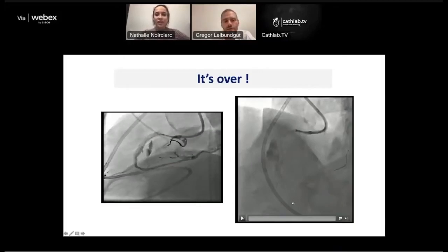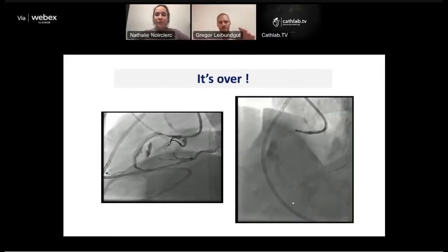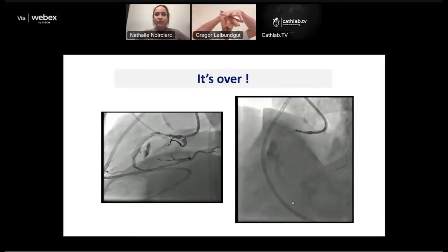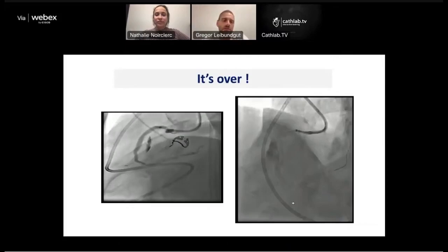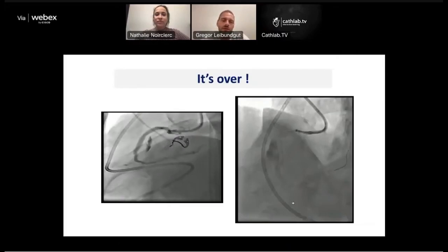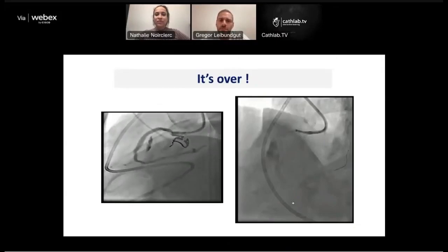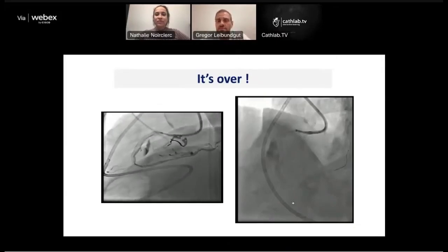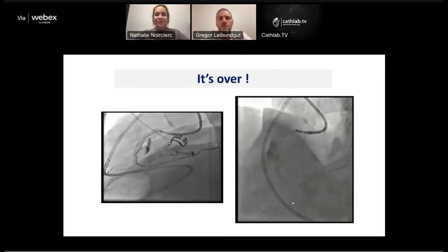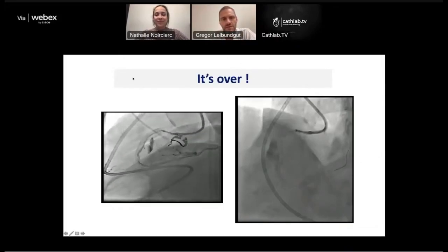Thank you. And of course, ultra-high pressure balloon dilatation is important. Again, remember, you have a rugged terrain and you place your PTFE membrane over it, and there are all holes in between where endoleaks can be created, and you can only flatten that with very high pressure. So if you still have an endoleak, take an OPN balloon and go to 50 atmospheres. Don't be afraid. It's a perforation, but the pressure doesn't harm the vessel as long as your balloon is not oversized. So these are some tips and tricks to bail out from an endoleak.